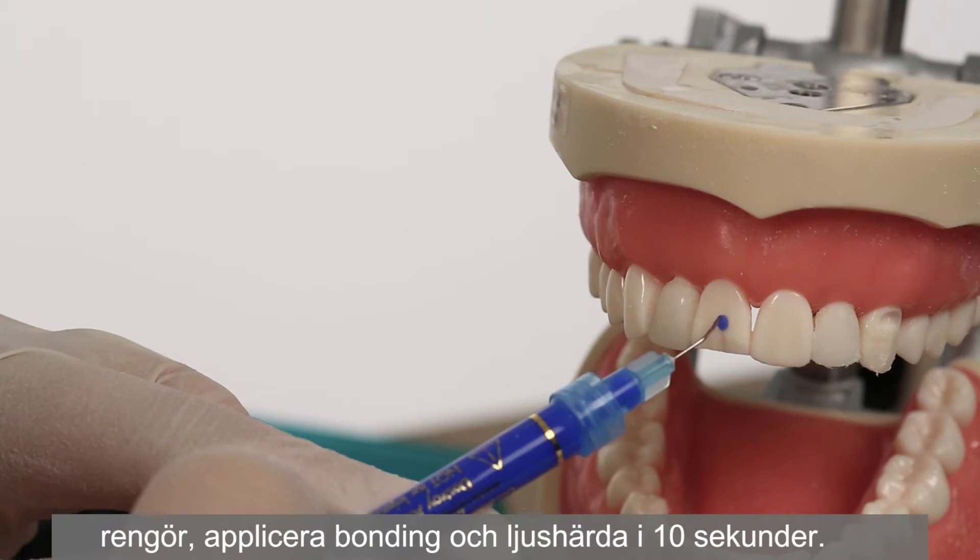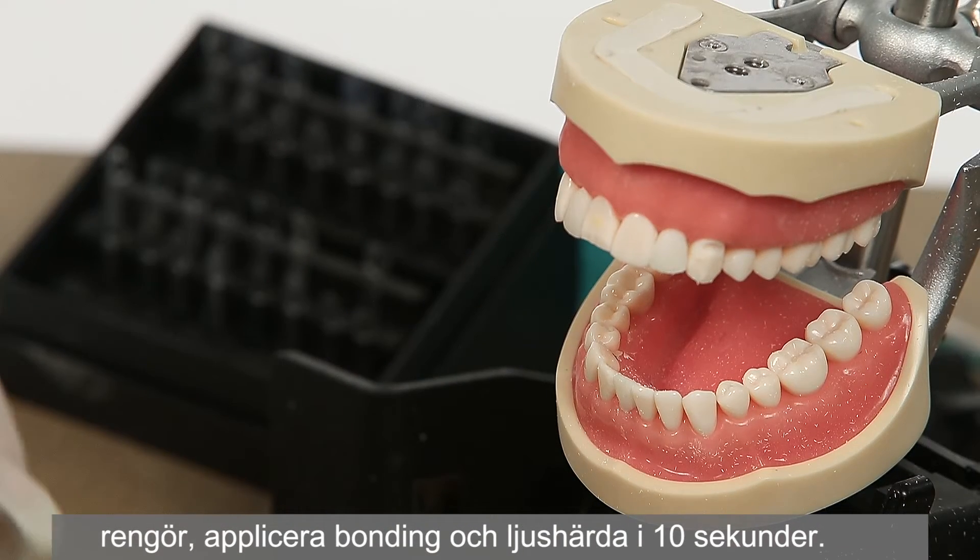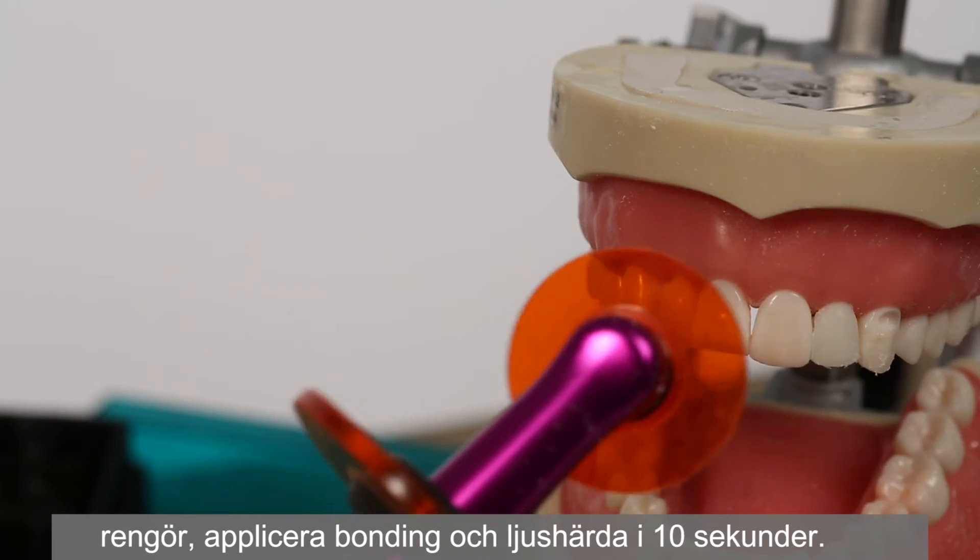spot etch, rinse, spot bond, and light cure for 10 seconds.